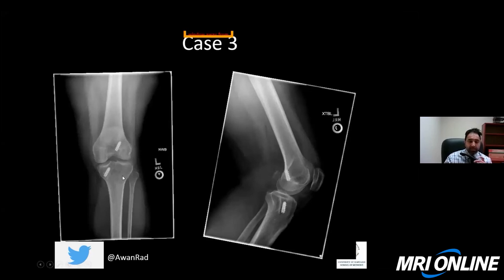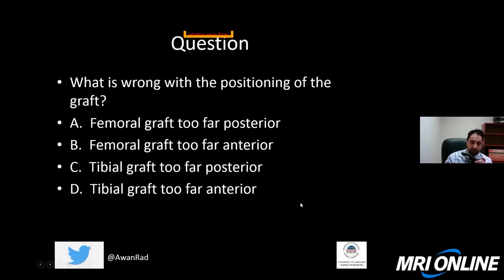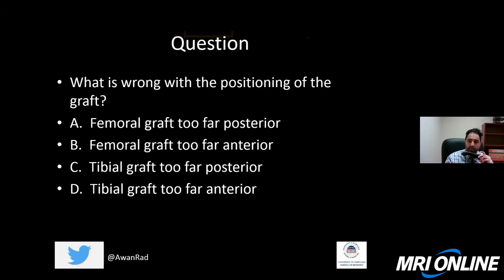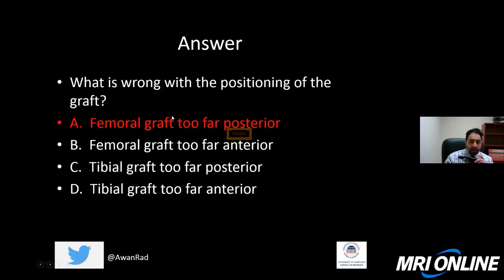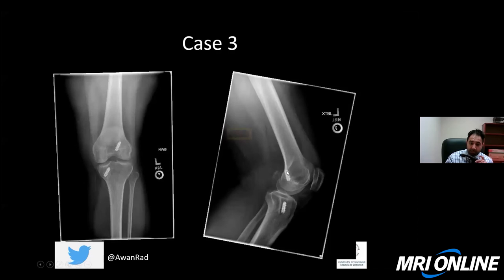Case three: this patient has status post ACL reconstruction with an abnormality on the lateral view. What's wrong with the positioning of the graft? Most people answered A — femoral graft too far posterior — and that's correct. This is a femoral blowout fracture. The femoral tunnel is placed too far posteriorly, resulting in fracturing of the posterior cortex of the distal femoral metaphyseal cortex. It should be placed one or two centimeters more anteriorly.